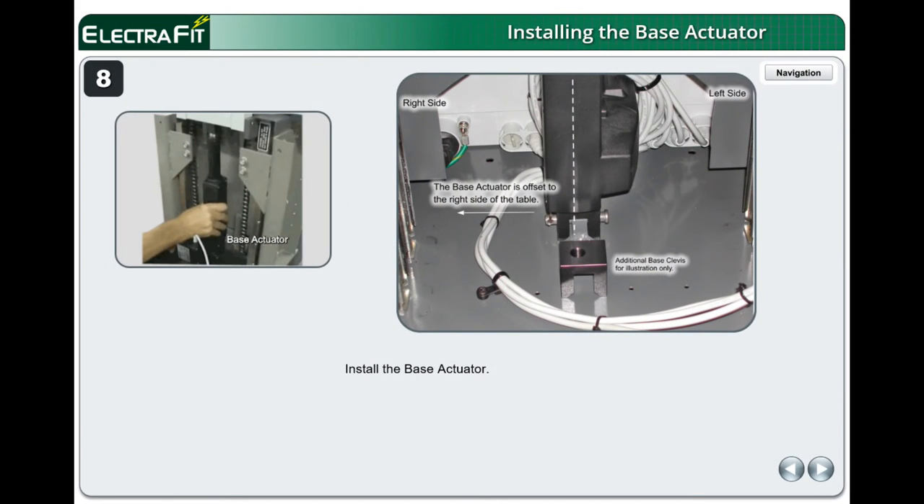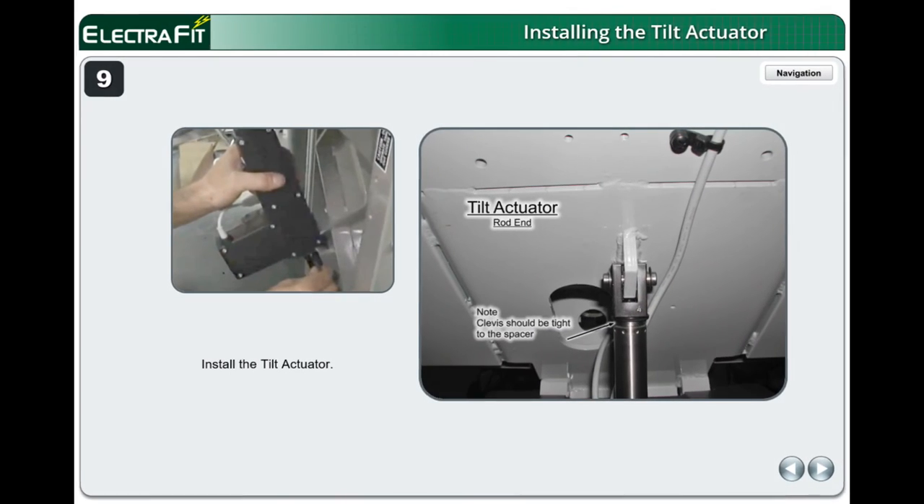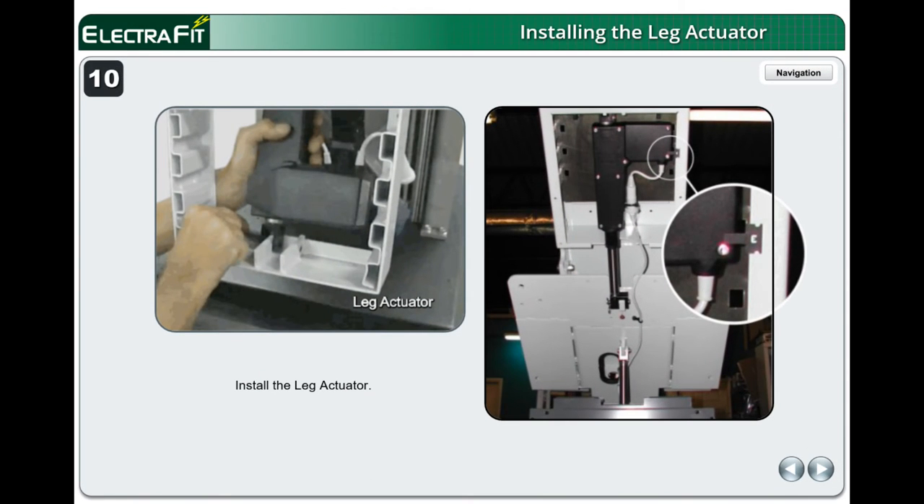Install the Base Actuator. The base actuator has a spacer under the clevis on the rod end. No adjustment should be necessary unless the table's base tang had been broken and was repaired with a base cylinder mount kit. Remove the rod end spacer if the base cylinder mount kit is present. Install the Tilt Actuator. Install the Leg Actuator — note the placement of the clevis.